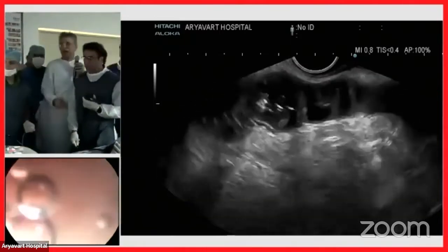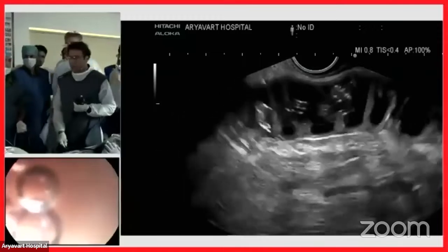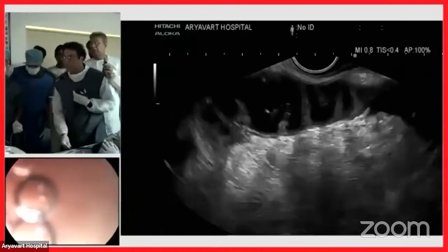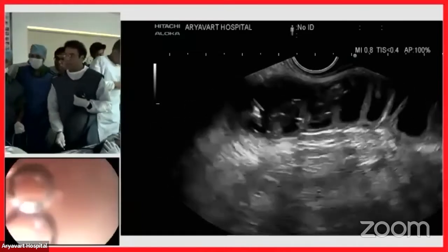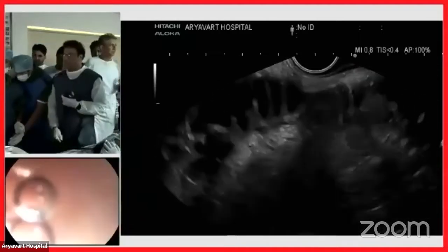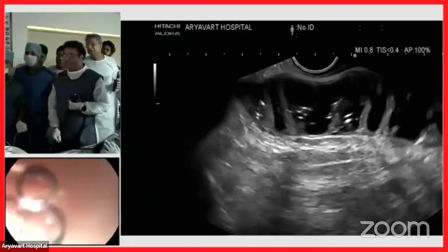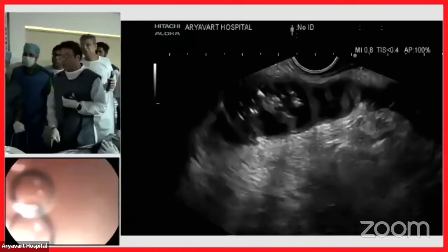Yes. Hi, Pravir. I had a question. What size of the drain are you using to distend the bowel? Are you using a 7 French nasobiliary drain or a larger one? Yeah, so in this particular patient, it's a 7 French endoscopic nasobiliary tube that is being used. As you can see now, the bowel is being distended. You can see valvulae conniventes running across, the fluid moving in.